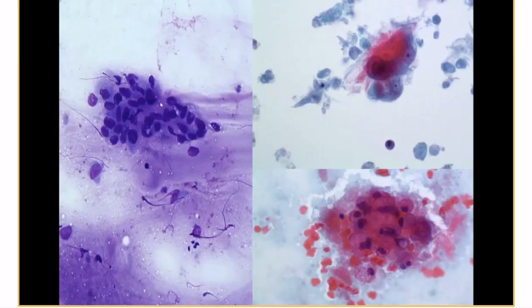So here you see the intermediate cells. They're somewhat small and they look like metaplastic squamoid cells, mucin in the background, and here you have a higher degree of cytologic atypia. Here you see the mucoid cells, somewhat bland. So if you have all these features, you may be able to make this diagnosis with the mucin in the background, or mucoepidermoid carcinoma, favor high grade.